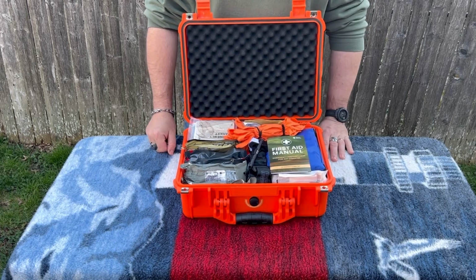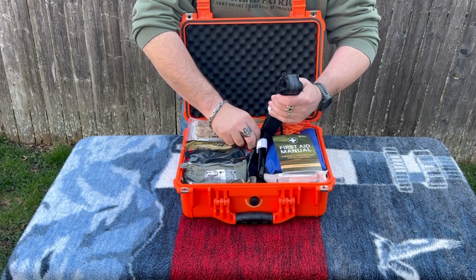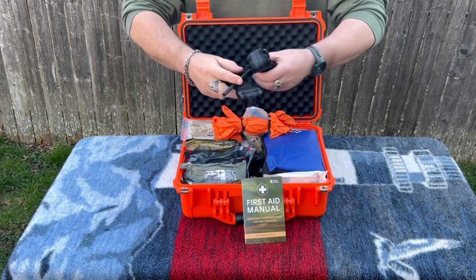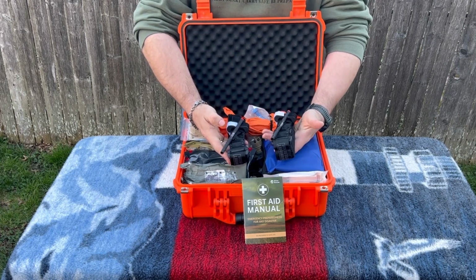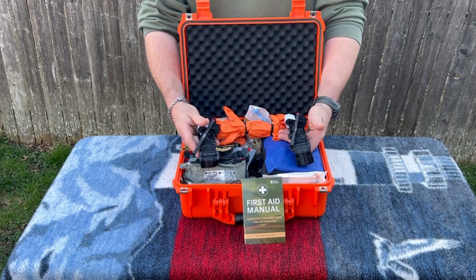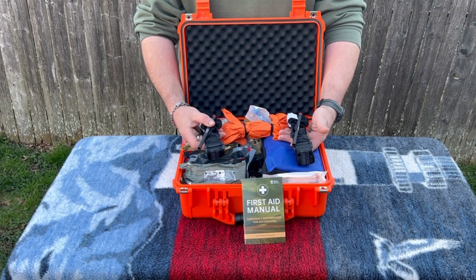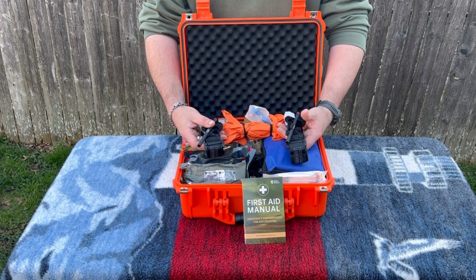So tourniquets to start with. There are two windlass style tourniquets in here. These are the new Rhino Rescue tourniquets. I am more than likely going to swap these out for Recons. It looks to me as if Rhino has purchased Recon's design just by the nature of how they're designed. But they're a little unproven as of yet, so these are going to be replaced with Recon tourniquets.